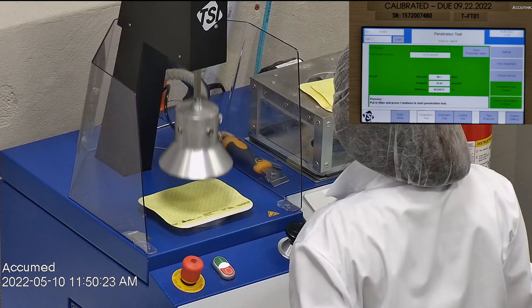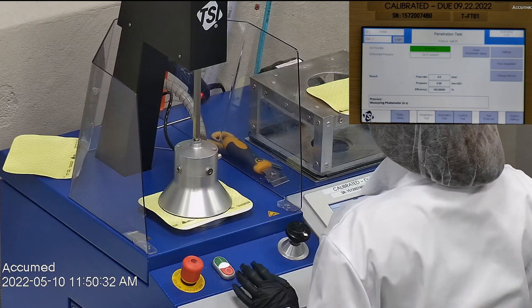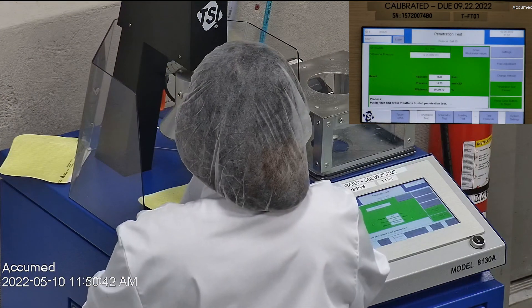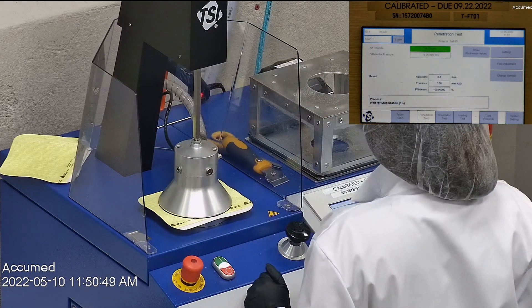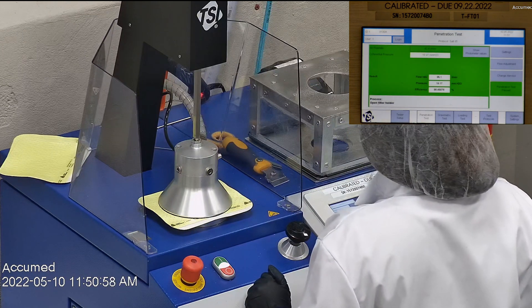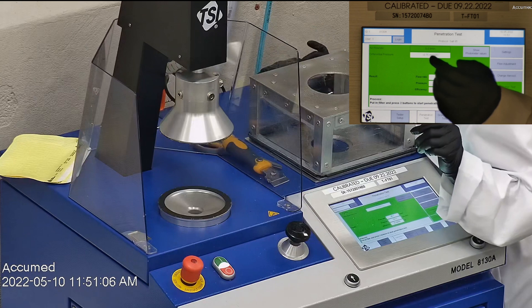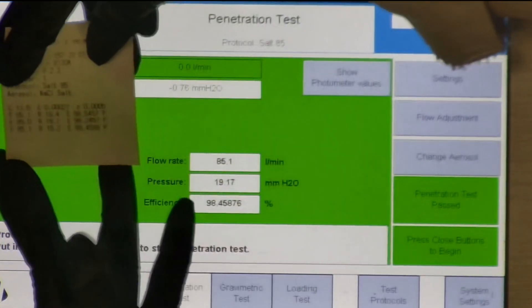The second sample had a filtration percentage of 98.25% with a pressure drop of 18.7. The last sample's filtration was 98.46% and had a pressure drop of 19.2 — still on the higher side, meaning these aren't super breathable, but they still pass the NIOSH requirements.